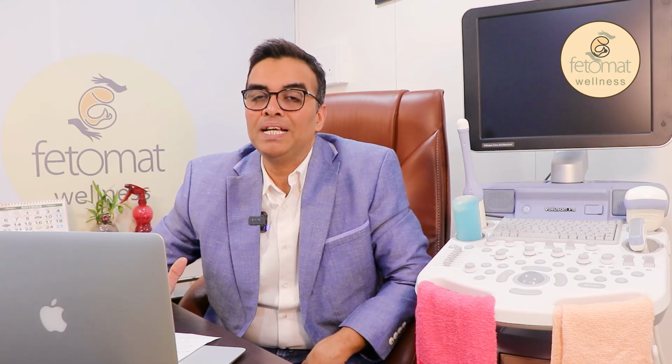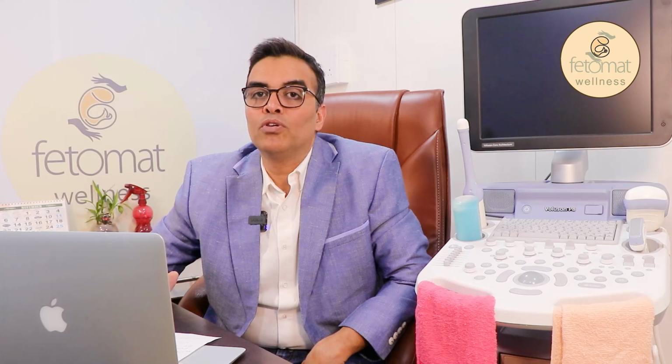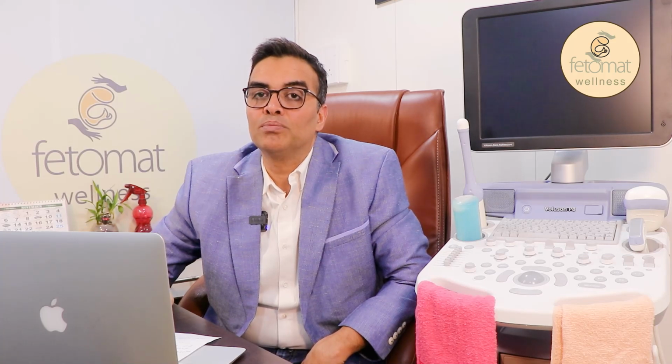Number one, we do a baseline scan to understand the pelvic anatomy, to look for any structural abnormality, as I have discussed with you before. The second step is to push normal saline into the endometrial cavity by the process called saline infusion sonohysterography, SIS, to delineate any intra-endometrial pathology like endometrial polyps or submucosal fibroids, synechia, and so on and so forth. And third step, last but not the least, is hysterosalpingo foam sonography, which is called HyFoSy.